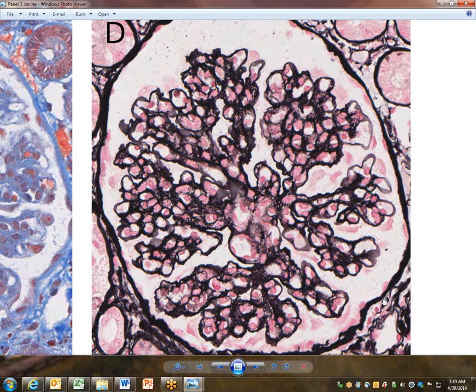So the silver, again, peripherally at like 3 o'clock they look okay, but internally I'm almost seeing some, I don't know if there's some double contours or some... Might be a little bit right here. Yeah, and then down from where your arrow was, it almost looks like a little bit of loopholes, kind of right at the center. Well, yeah, but that's sort of out in mesangial areas. You'll want to look for double contours out in the peripheral capillary loops.